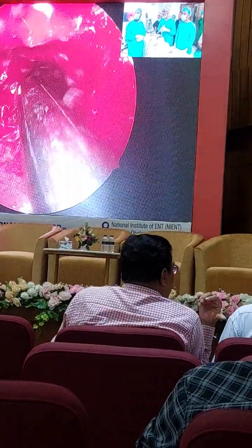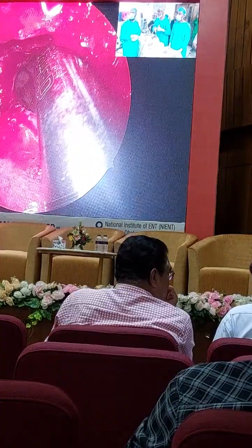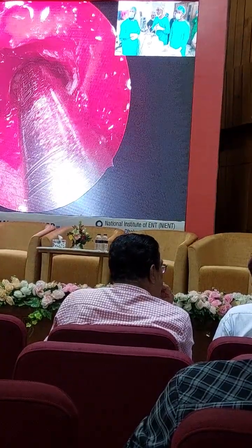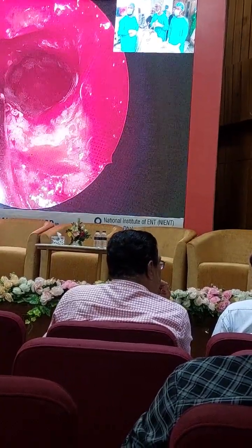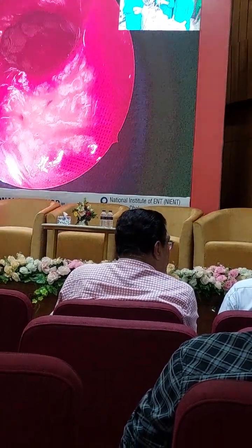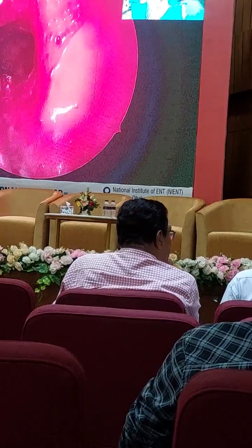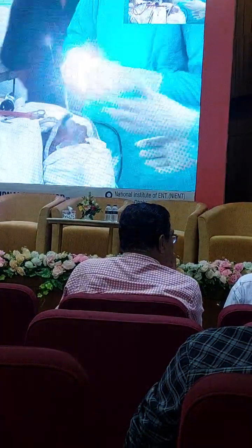Okay, so now we have a nice wide maxillary sinus coming all the way anterior to the normal maxillary ostium, and reasonably posterior. We still have good mucosa around the edges, so we don't need to do any more. We now will convert back to a 0.